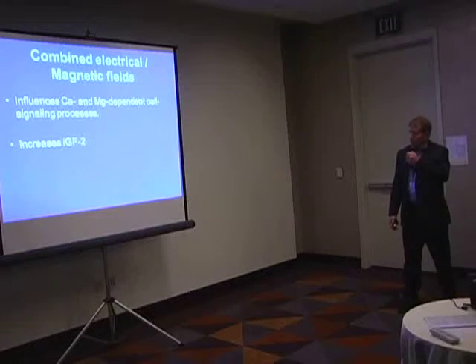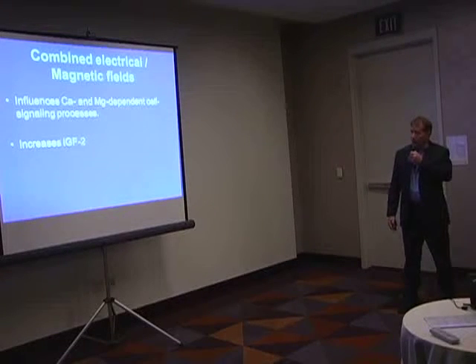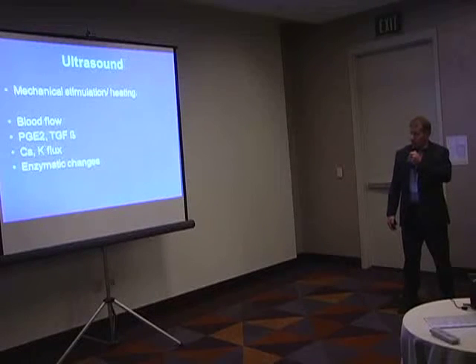And then finally, these combined devices have been shown to affect all these various cell signaling processes, ultimately leading to increases in the levels and function of these signaling molecules.